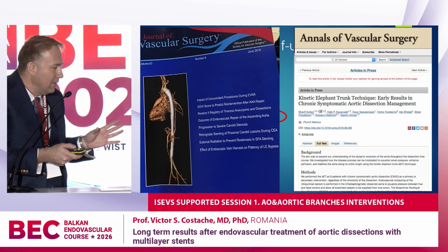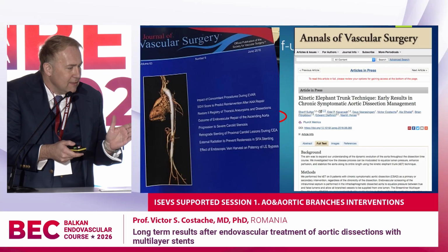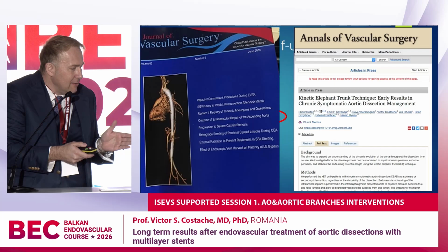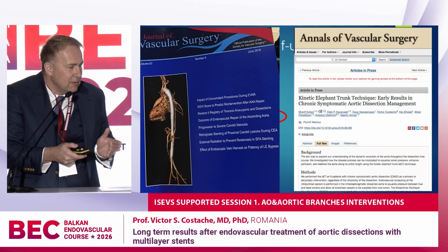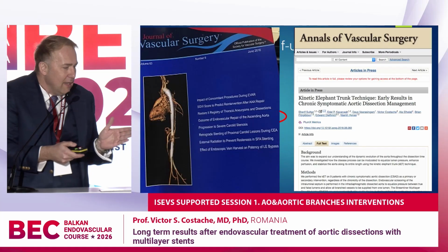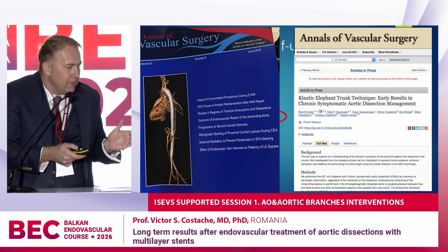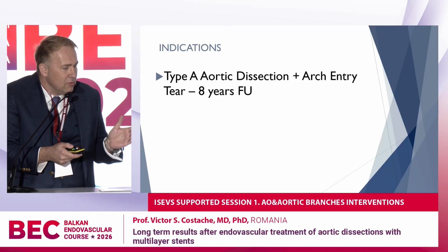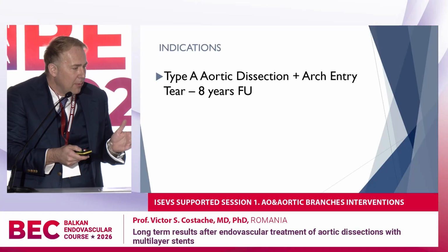lot of scenarios. After using multi-layer stents, we did the first case in 2015, and we published the first case with complete remodeling in 2016 in the Journal of Vascular Surgery, and then in 2018 we published in Annals of Vascular Surgery the kinetic elephant trunk technique for combining surgery and multi-layer stent in aortic dissection. These are two of my longest follow-ups, up to 8 years.